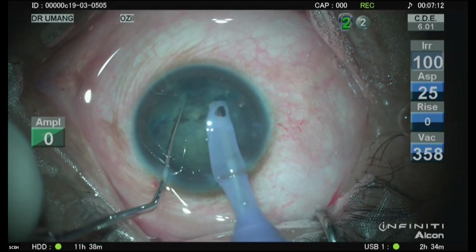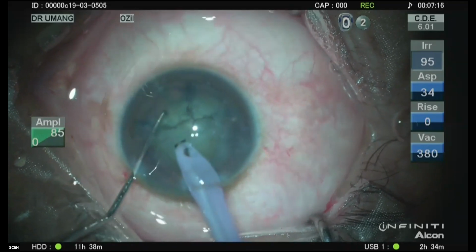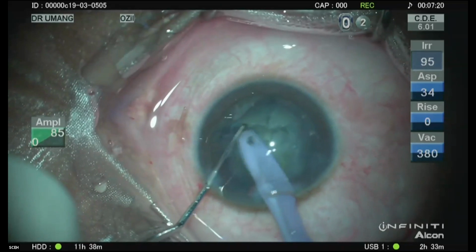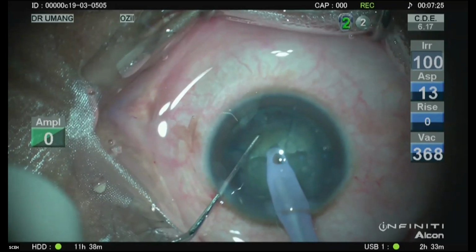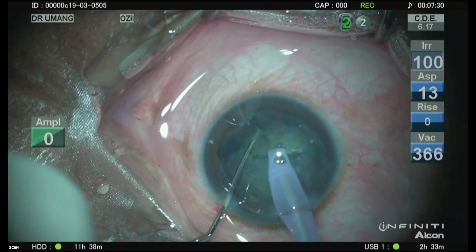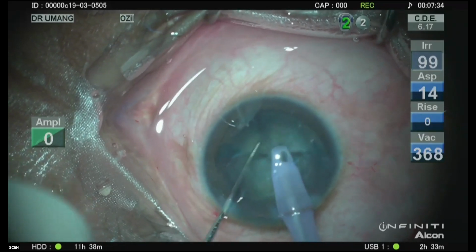And I separate now with the third crack. So this is the in situ cracking at multiple levels. So you hold it well, dip down, you get halfway, we've got a chop, further down, and then you separate.